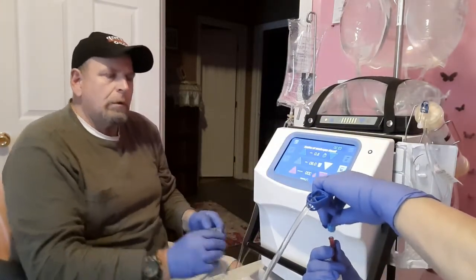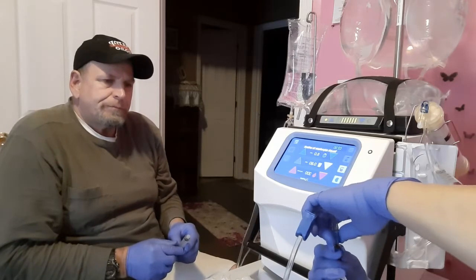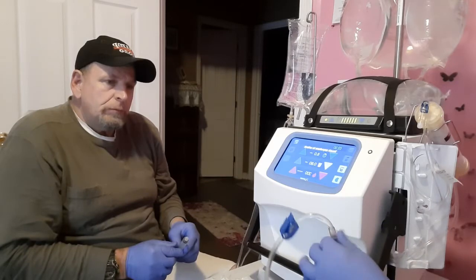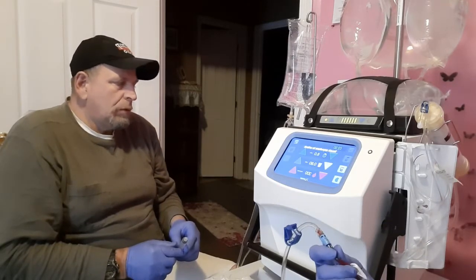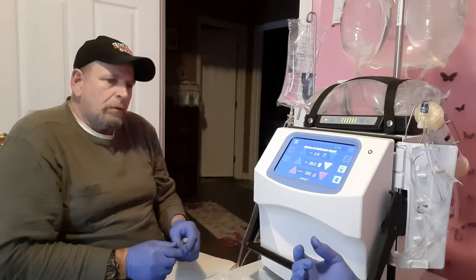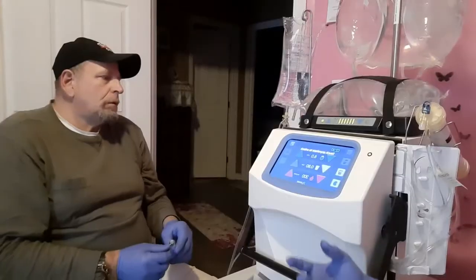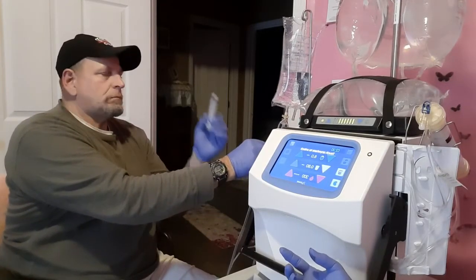Hold on. Don't do it yet. And I'm going to attach it to my venous syringe line. And then I'm going to unclamp and unclamp. So I'm done with this right now. Now, Hofstra, fine. He's going to take that syringe. Show the syringe. It's a 10 milliliter syringe.